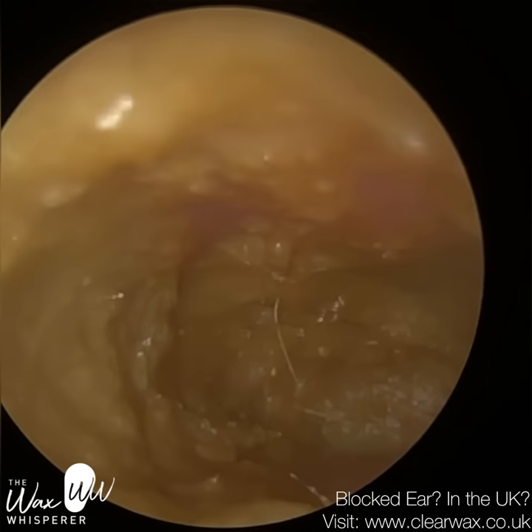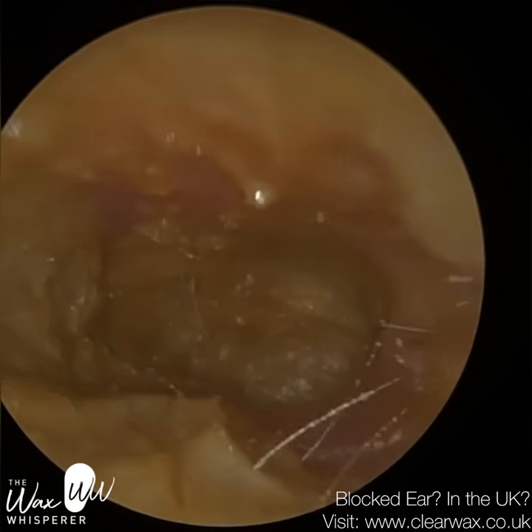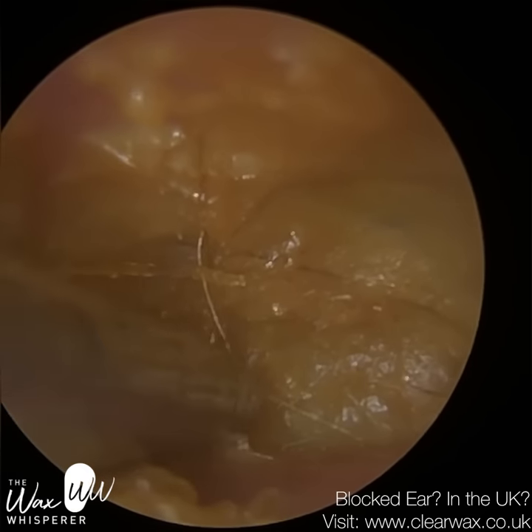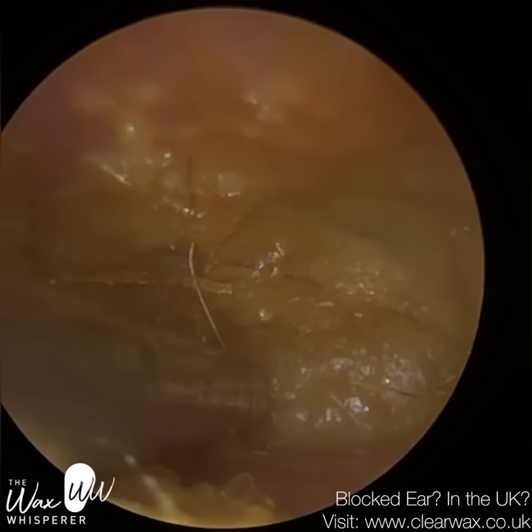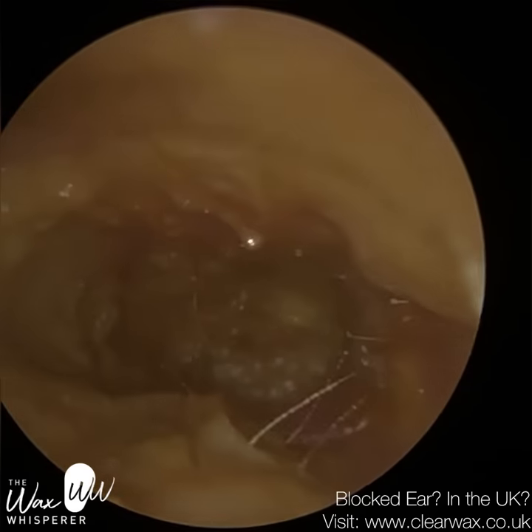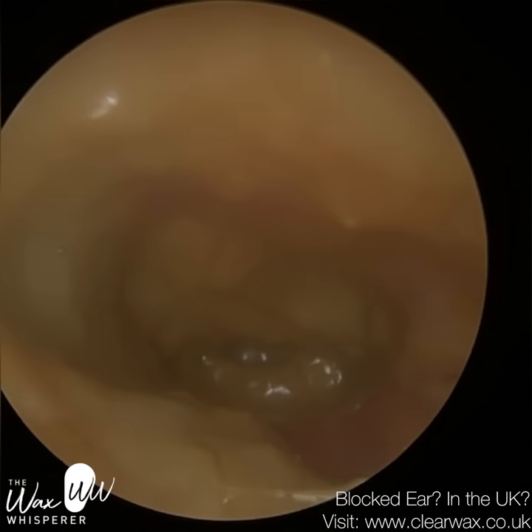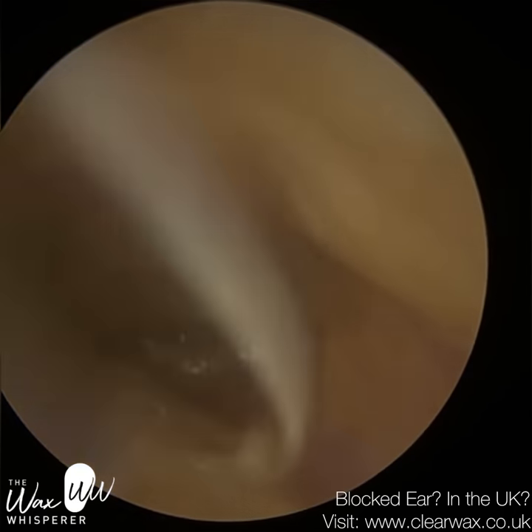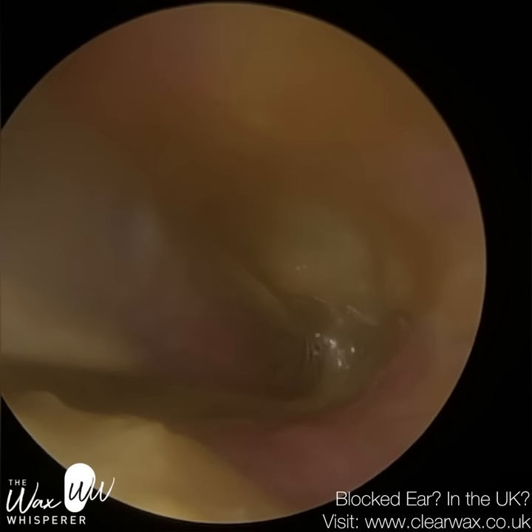So we're slowly but surely clearing as much debris as possible. I don't want to poke too hard with the suction probe because I just don't know where the eardrum is in relation to this thick consistency of dead skin lining the eardrum. The posterior part is slightly swollen, so I've just put a bit more drops in. The olive oil is going to help because it will help moisturize the skin — this is something they've been advised by ENT as well.